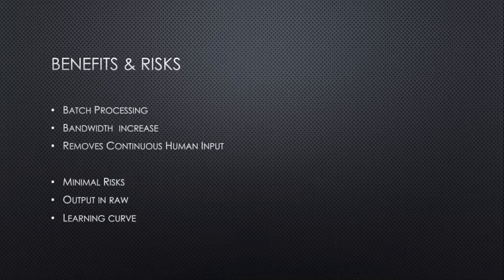There are minimal risks, in my opinion. The output is still raw. However, we have written MATLAB scripts in the past which will just read the header and sort everything into its own folder hierarchy based on what it finds. So that shouldn't be a large problem since we've already solved it.